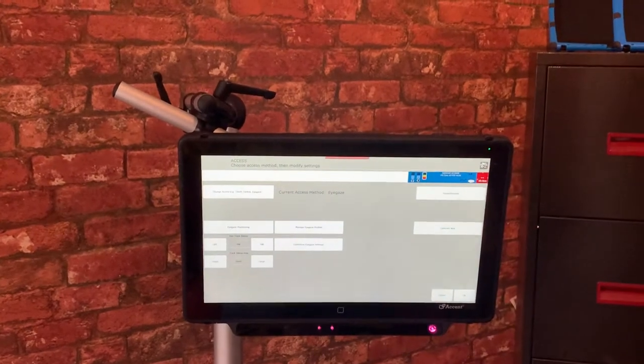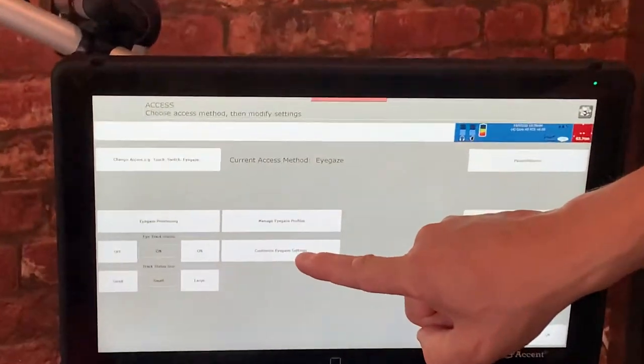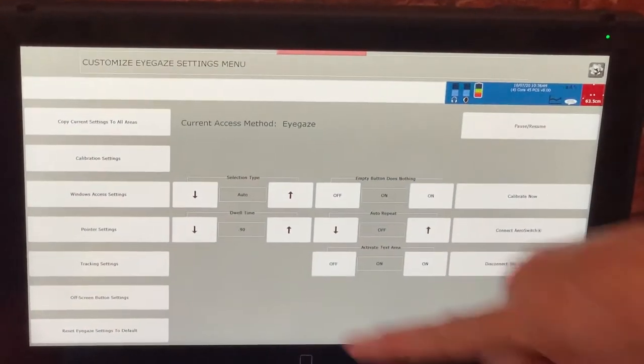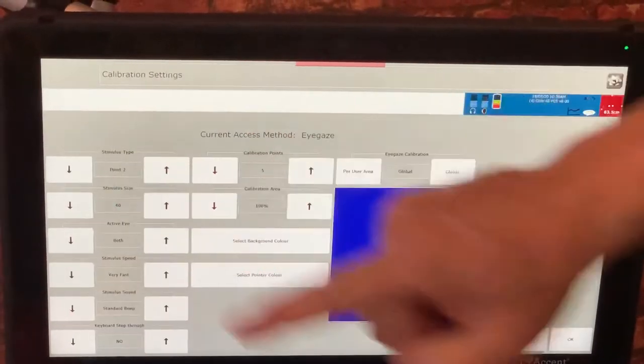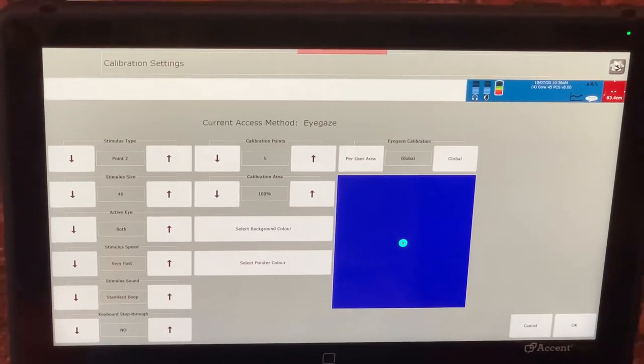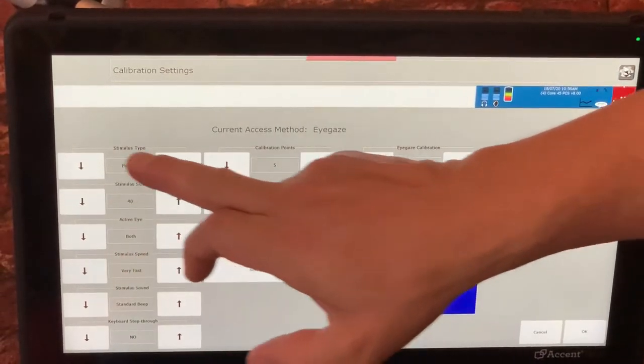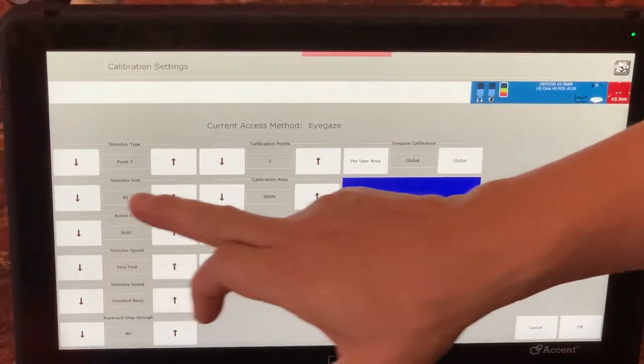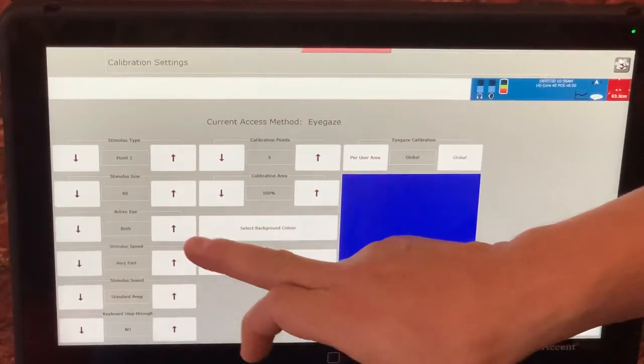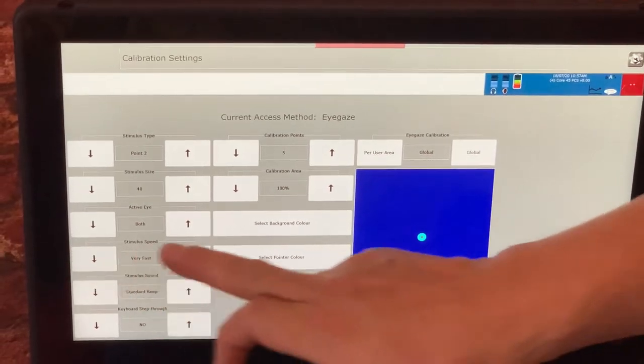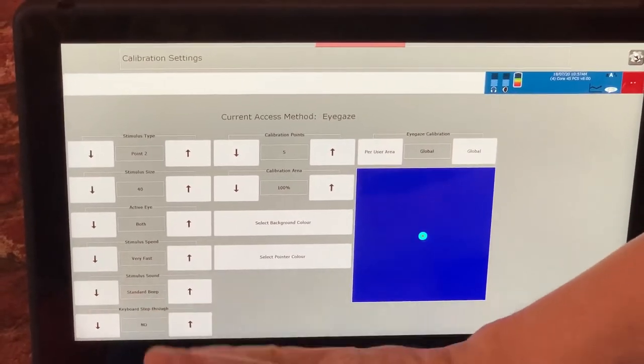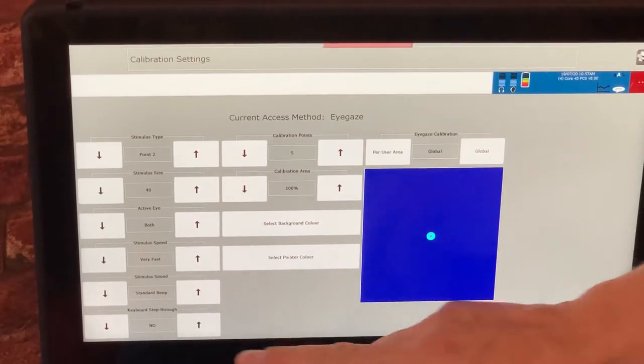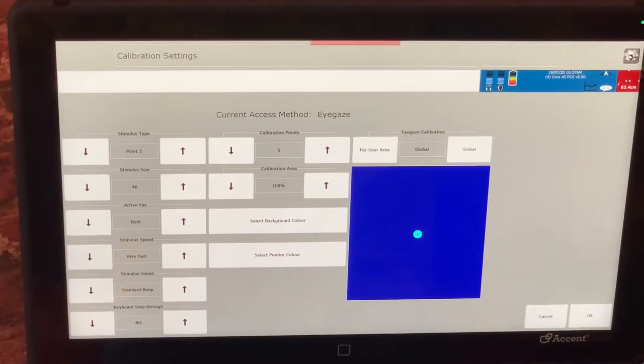Before I go ahead and calibrate I'm going to go into customise eye gaze settings. I'm going to go into the calibration settings itself and just show you the preferred or the ideal settings there. I've got this set to point 2, I've got the stimulus size set to 40, both eyes are active, the calibration speed is very fast, the stimulus size sound is a beep that's fine, keyboard step through no and five calibration points.